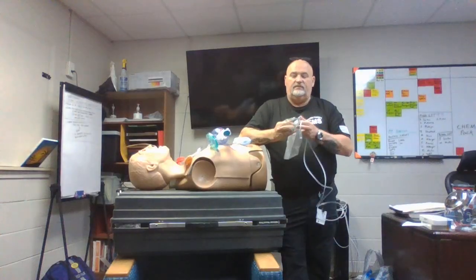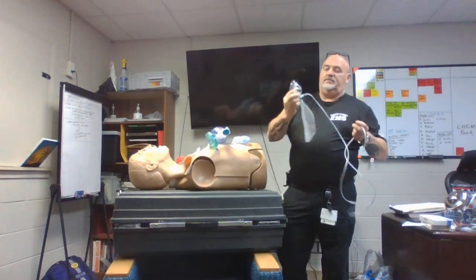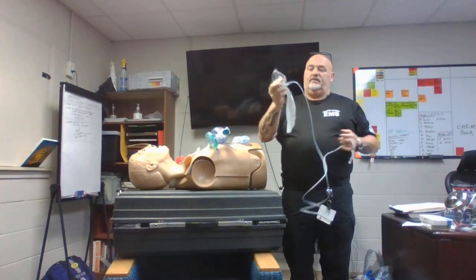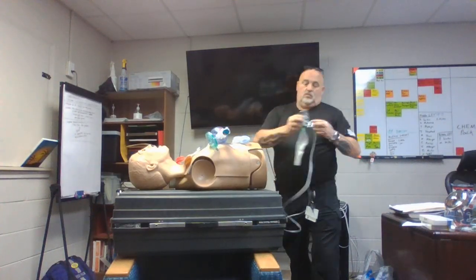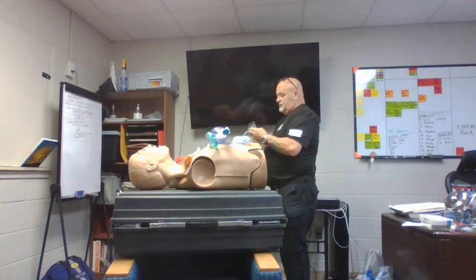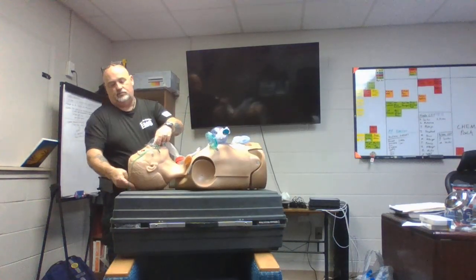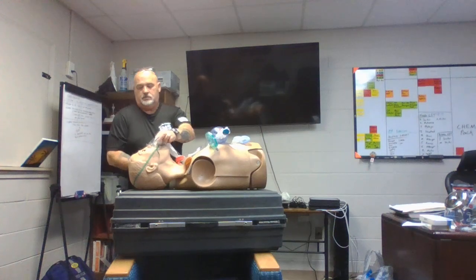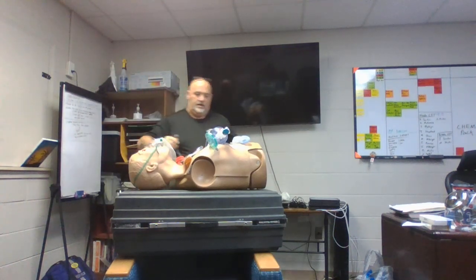There's a little valve on the inside. I've seen some people take their finger over the valve and the bag will fill up. Then we put it on the patient. What you don't want to do if you're going to move this patient, let's say we filled up the reservoir, all that good stuff, right? It's hooked to oxygen, and we've got that on the patient, and their SATs are improving, and everything's good. And then we're going to move them.